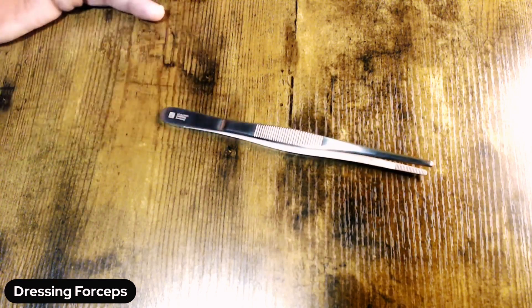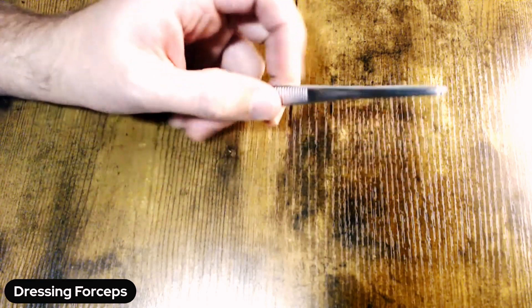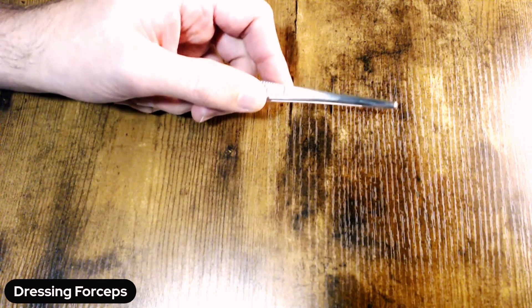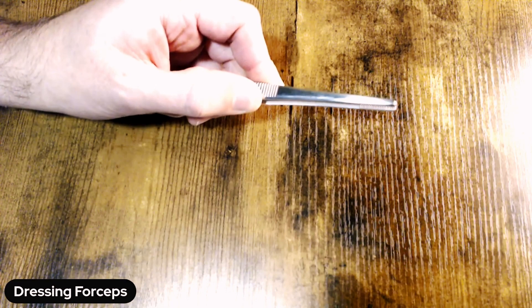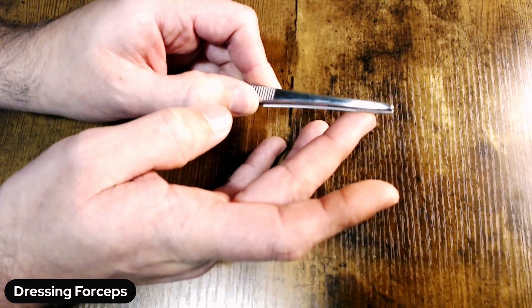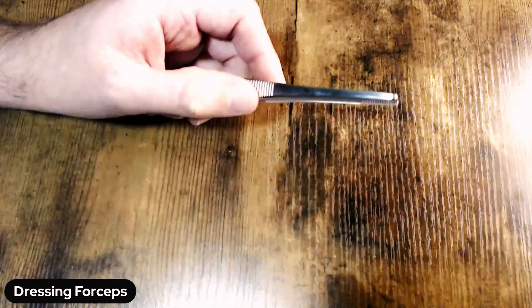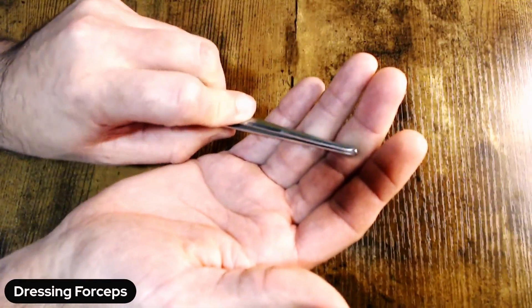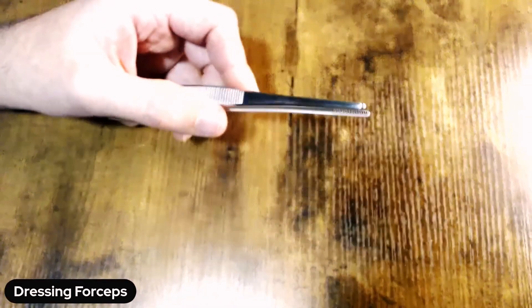Finally, on the functionality portion of these, with all your forceps, you're going to want to make sure that the jaws align as they close. Okay, so any overlap you see there—you can kind of see the serrations on the bottom here—that's what you do not want to see if you are inspecting a forcep. You want it to be completely solid and mated. No overlap on either side of the forceps itself.